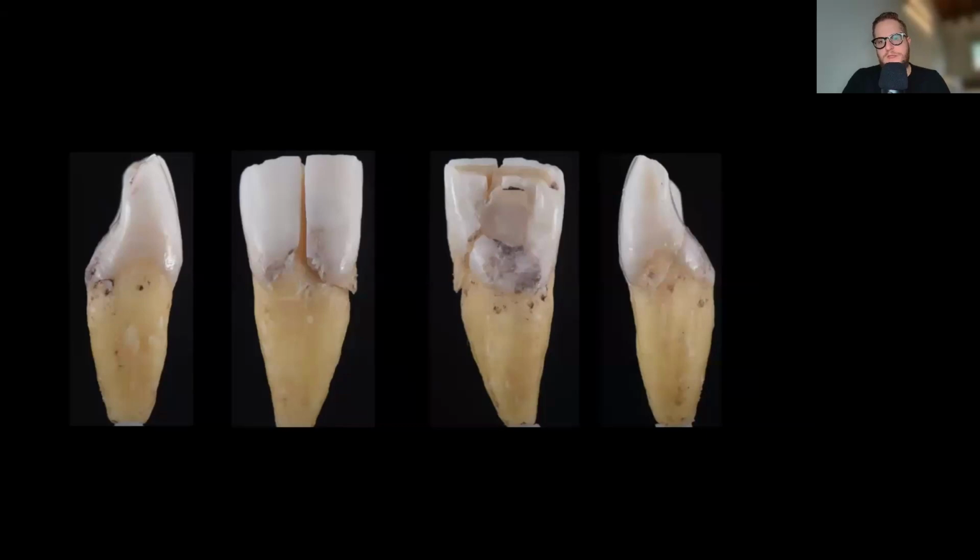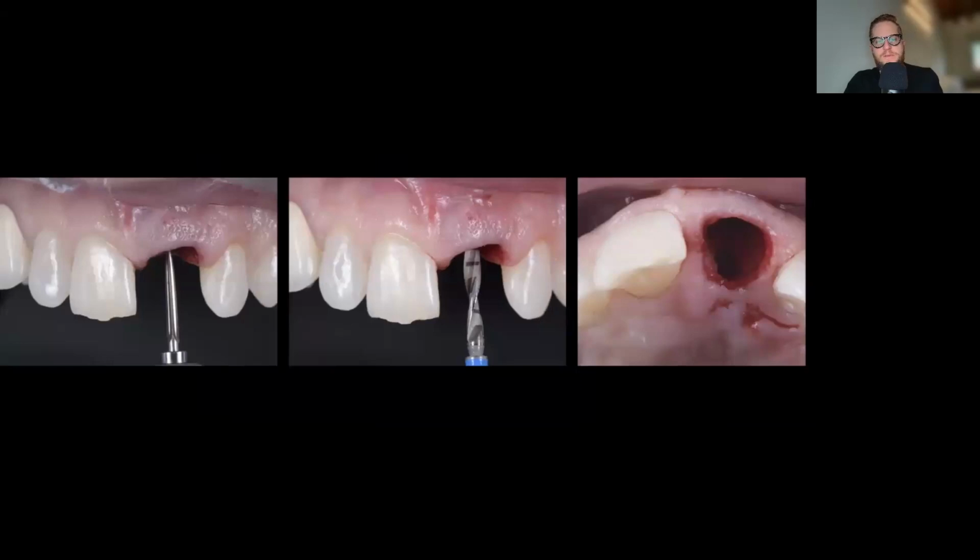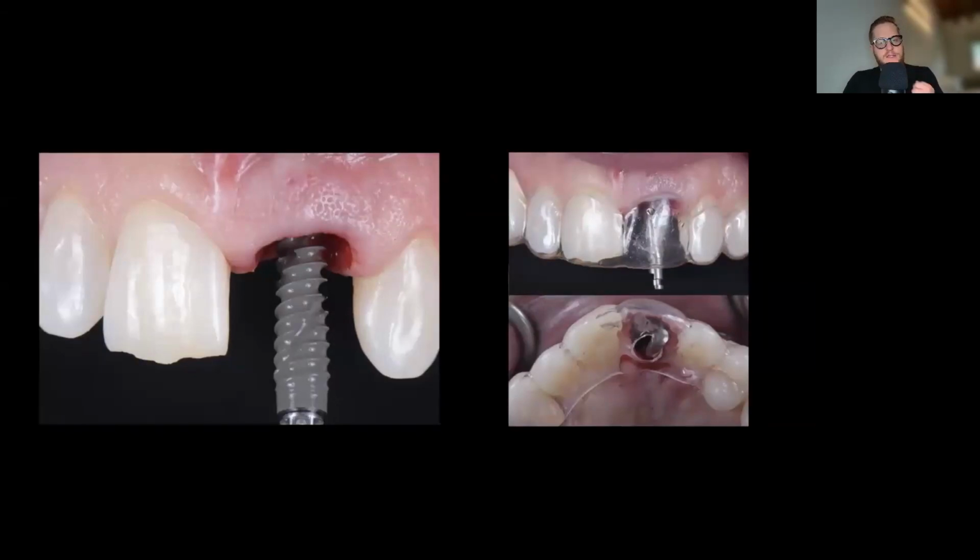So we thought that it was a good option, looking backwards in hindsight, to have chosen the path of extraction and implant placement. So we go through the same process. We go through the drilling and implant placement. In this case, we're using a different type of implant that's a little bit more active, and that helps with initial stability, but we're still using an analog guide.